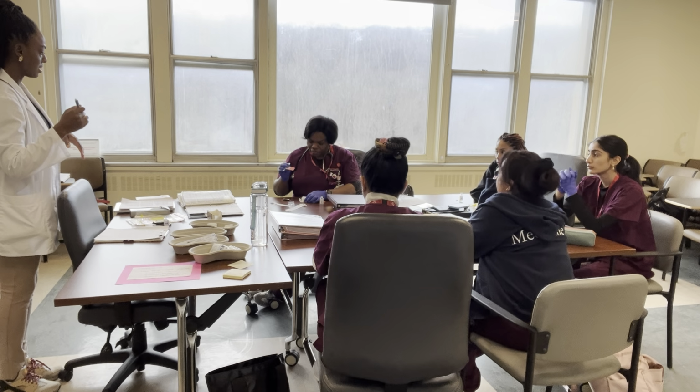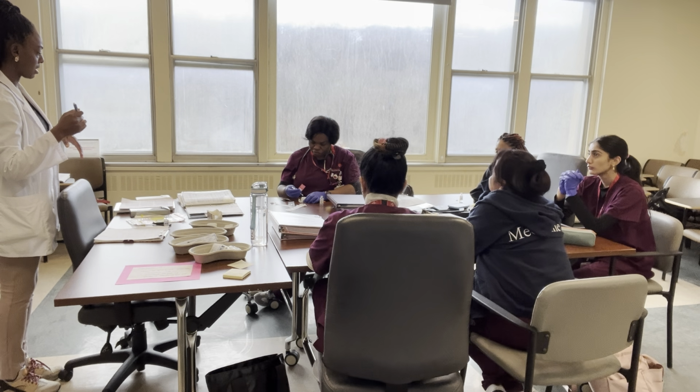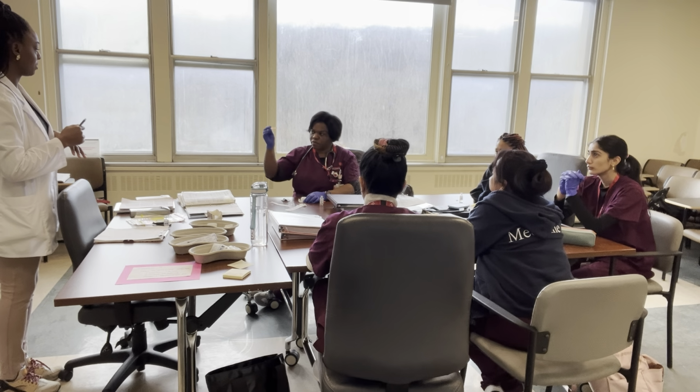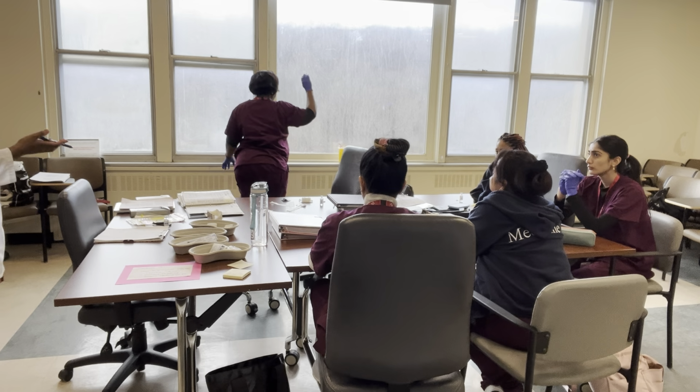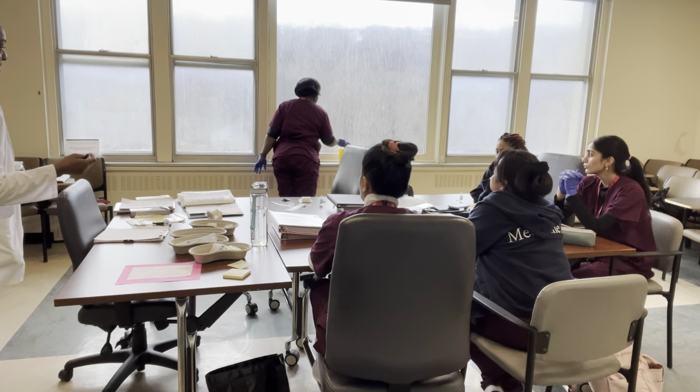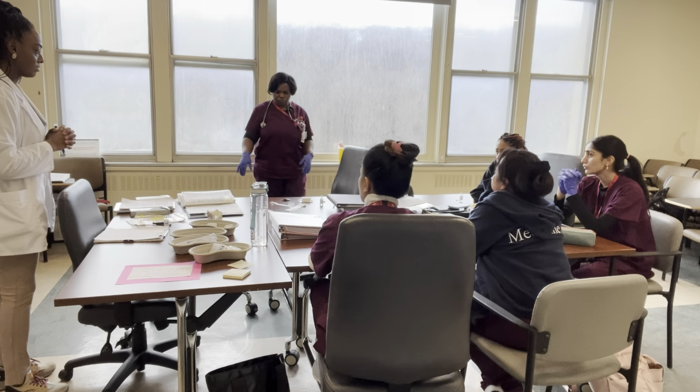So go back in the skin. I just want to see the process of you coming out. So pretend like you're coming out. Good. Come out of the patient's skin. You already gave it, you waited 5 seconds. Good. Now what do you do? Beautiful. Because no one's next to her, she wasn't saying needle. See the difference? That was good. Leave it. Perfect. Don't worry, I'll take care of it. Awesome, that was good.